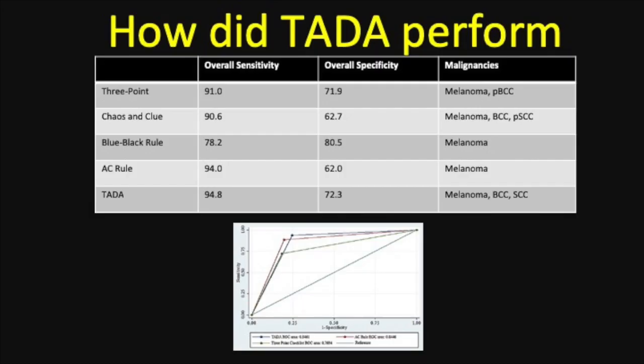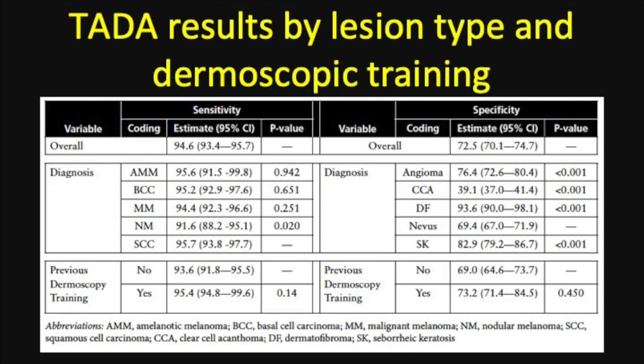How well did the TADA algorithm do compared to the other triage algorithms? You can see that it performed quite well in sensitivity and specificity. But the most important part of this is that this does not require a ton of expertise, right?